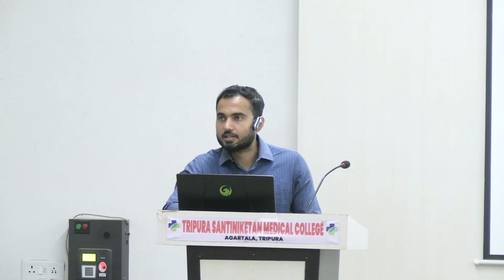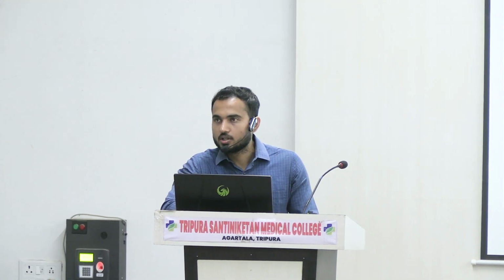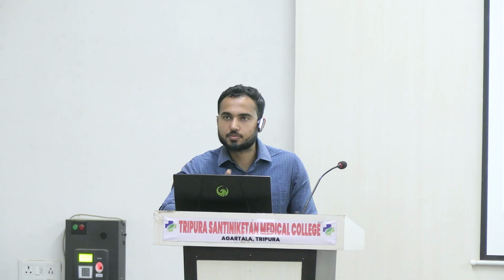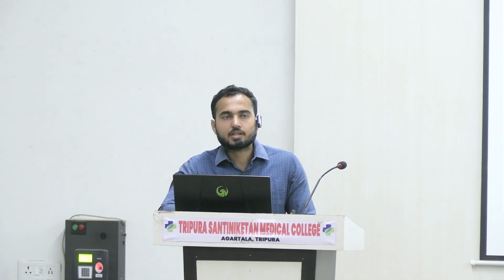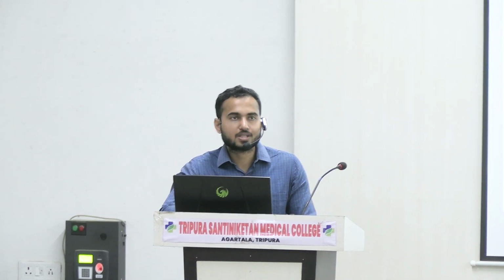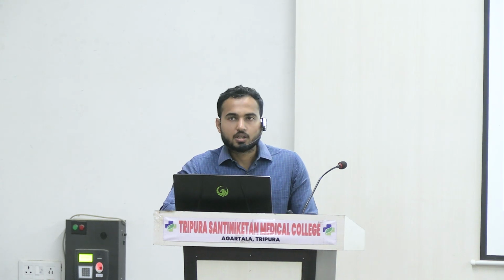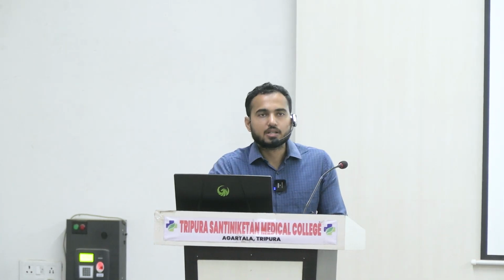Okay. So if you see the histology of pancreas, first of all, we know that pancreas is both an exocrine and endocrine gland. So two parts are there. Whenever you are studying or writing about the pancreas, you have to segregate it, that means the exocrine part and the endocrine part separately. Don't mix it. Now, before starting with the exocrine and the endocrine part, what you have to know is about the connective tissue capsule, about the septa, about the lobes, which is almost similar to the liver.